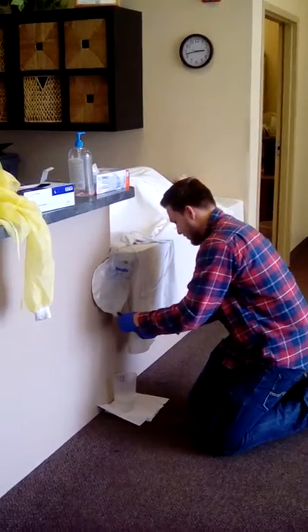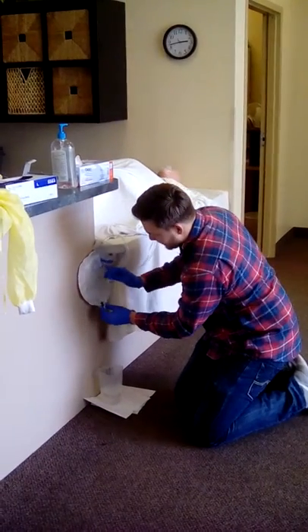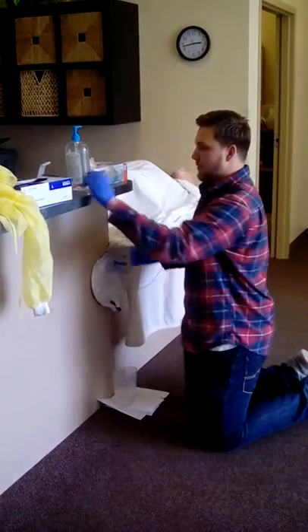Wipe down the spout, wiping away from the bag. Put it back in the hole. Throw away the wipe.